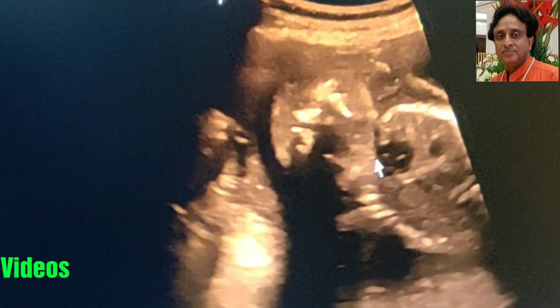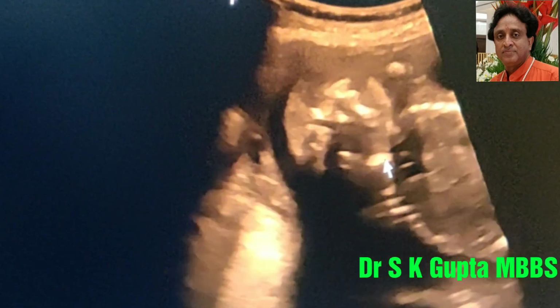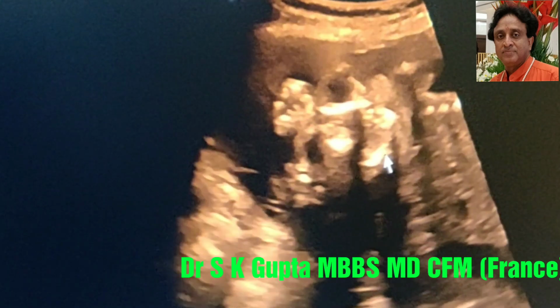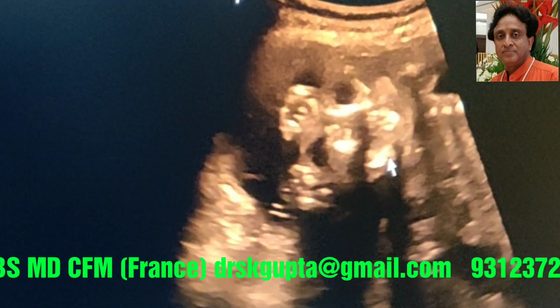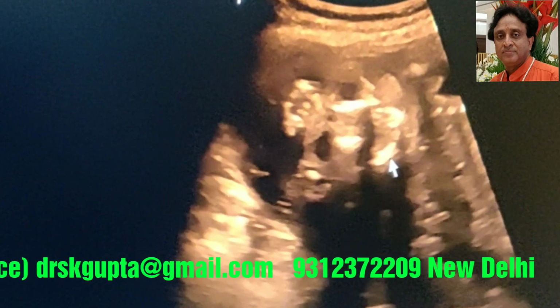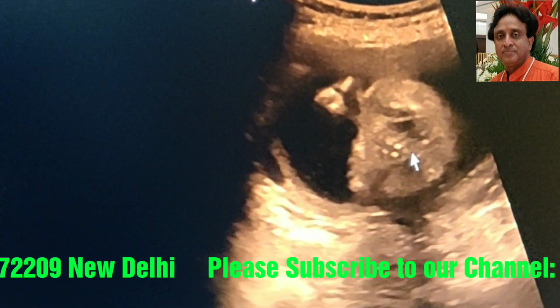Initially, the pregnancy starts with acrania, the absence of the fetal vault, and the brain tissue develops. Both the hemispheres start hanging with the spinal cord, and in due course of time, the brain tissue degenerates and it becomes pure anencephaly. This is the brain tissue that you just saw.